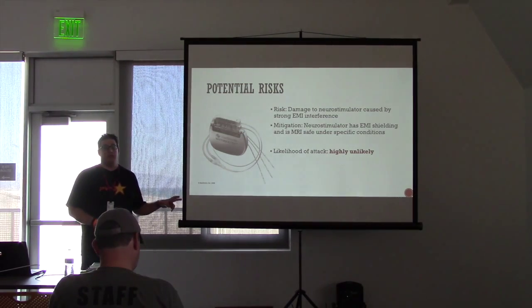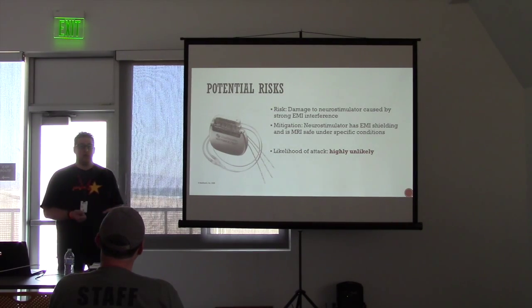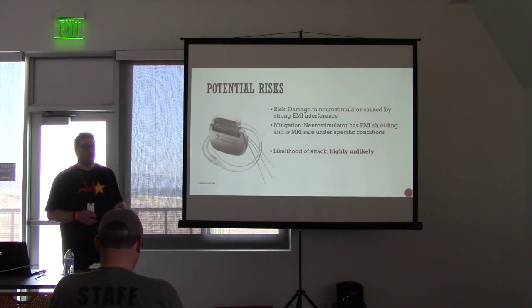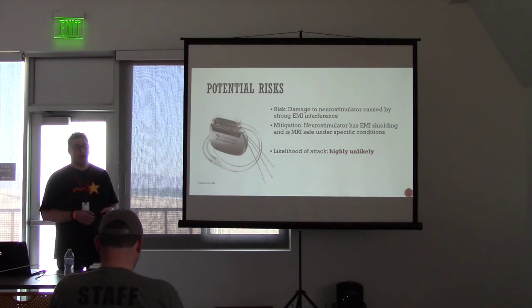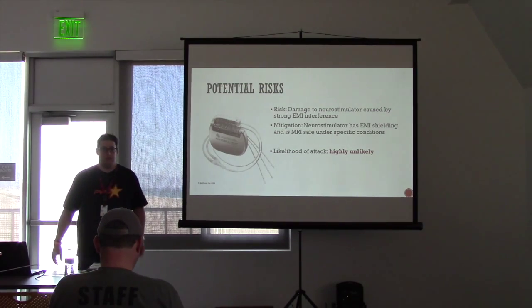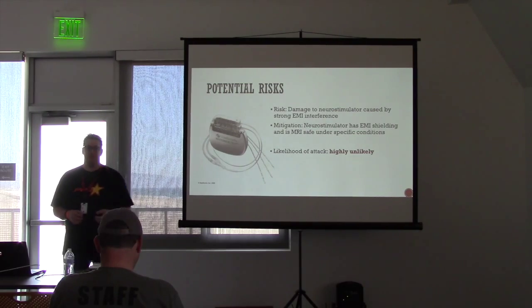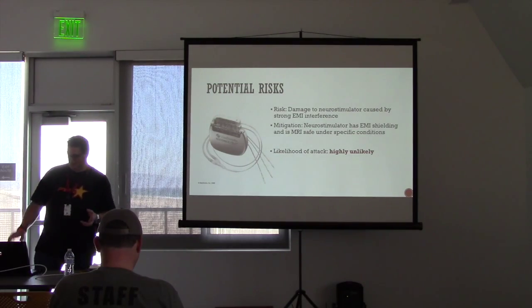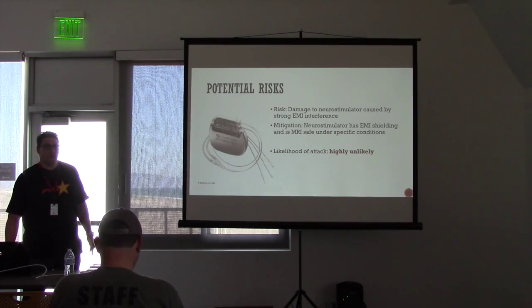In MRI mode, it actually requires the clinician programmer to put it in MRI mode. The ones that are MRI safe have very little ferrous material. They're all titanium and aluminum. And there's enough of a gap to prevent what they call unintentional charging or unintentional stimulation. But yeah, it was one of the considerations.